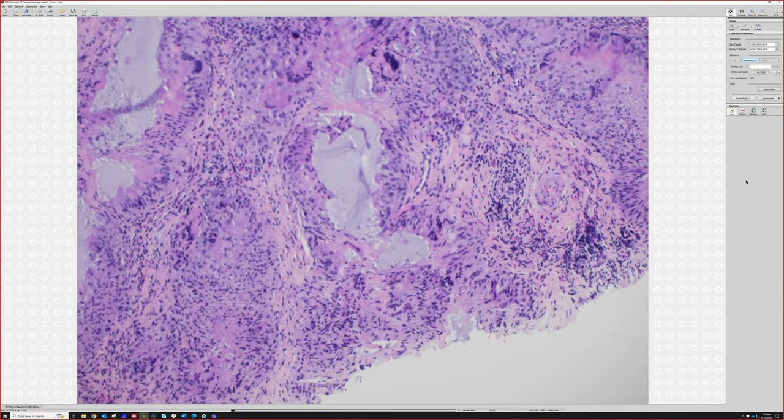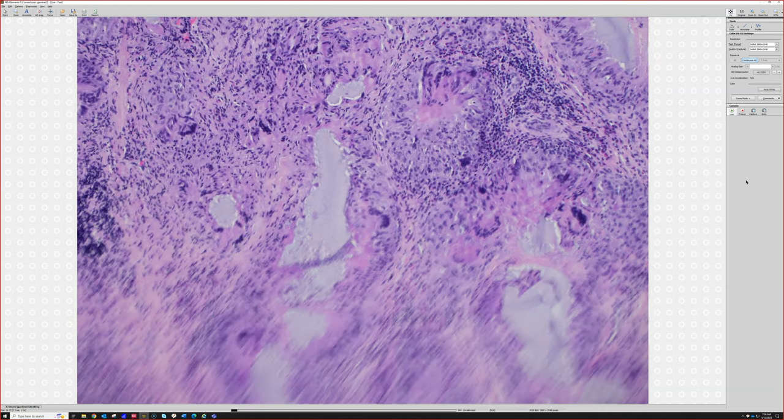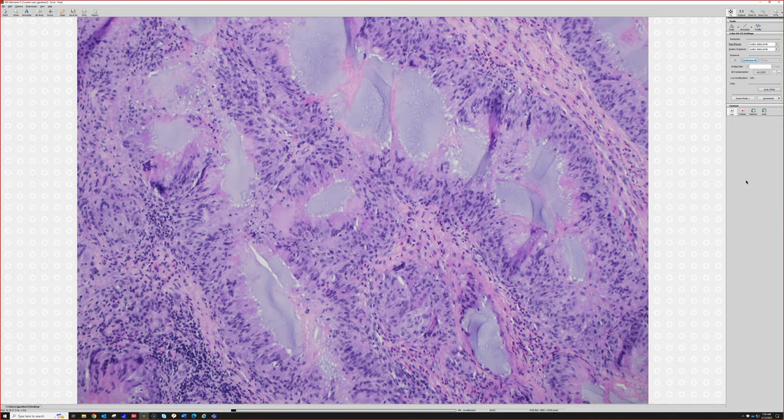Very good. One other thought you could have is a ruptured mucocele, but in ruptured mucoceles, the mucin doesn't look this dense and blue. And I've seen granulomatous stuff with them, but never like this. It's always loose, slightly bubbly, foamy, mucin-filled histiocytes vaguely around an area of ruptured, dilated salivary duct. But I've never seen these incredibly tight, palisaded, foreign body type granulomas like this. If someone watches this online and has seen otherwise, please educate me, but I don't see tons of mucoceles, but anyway.